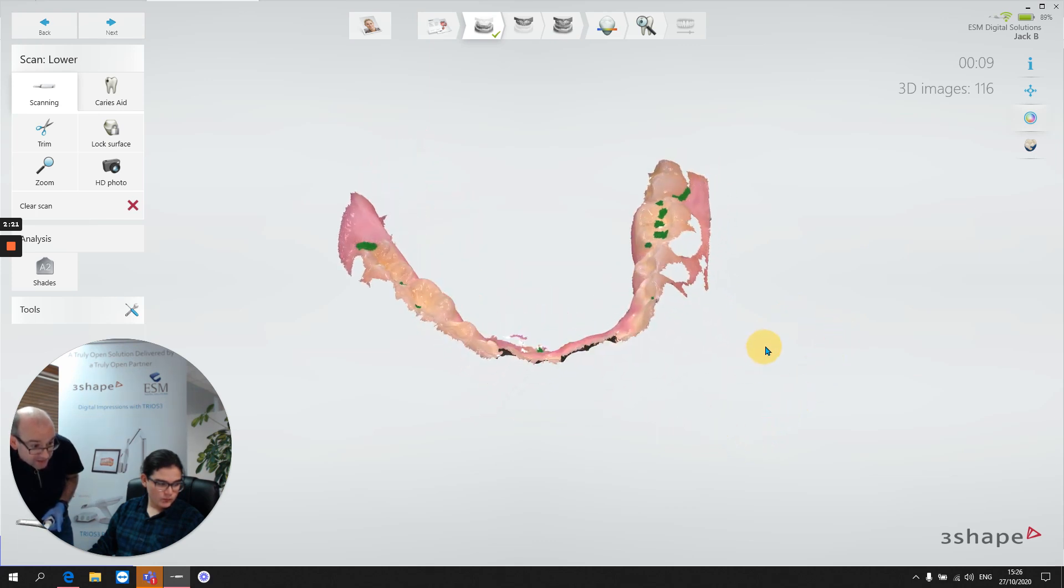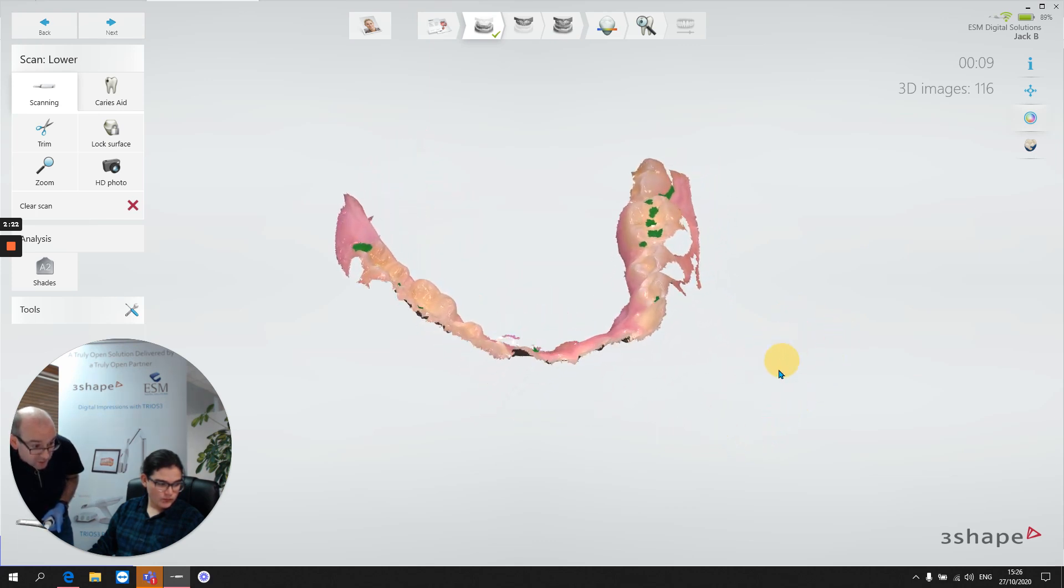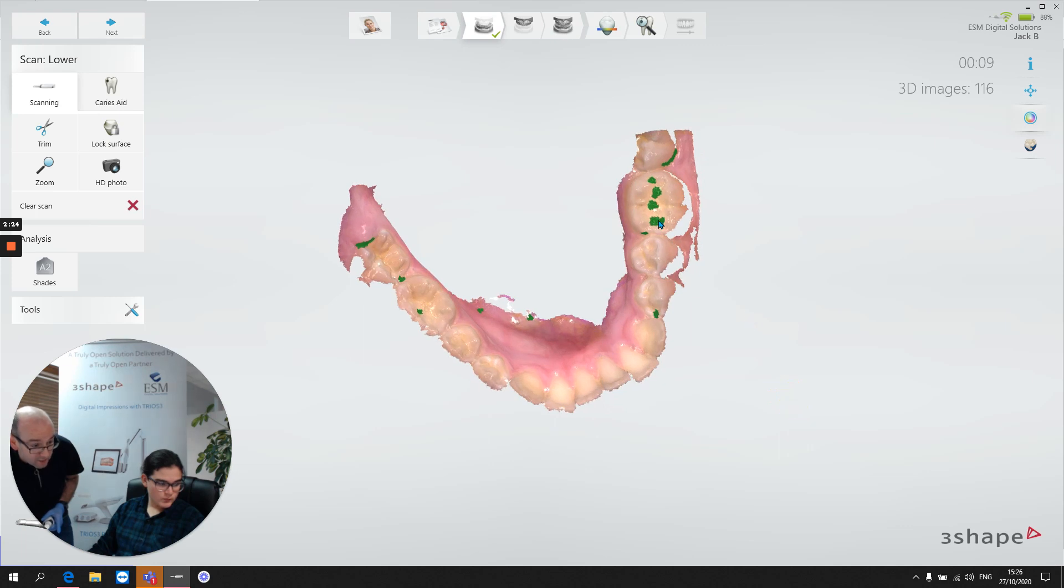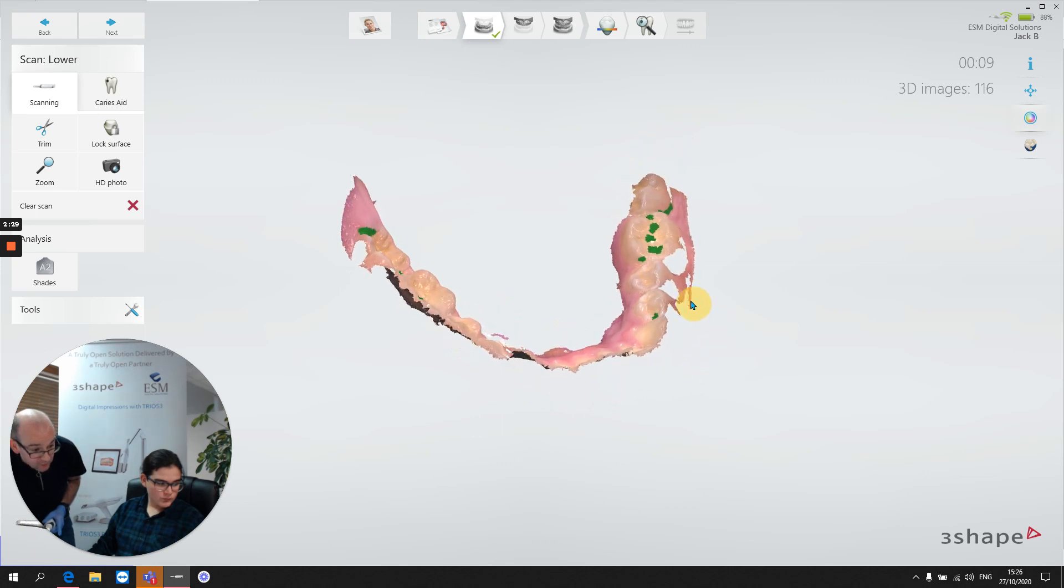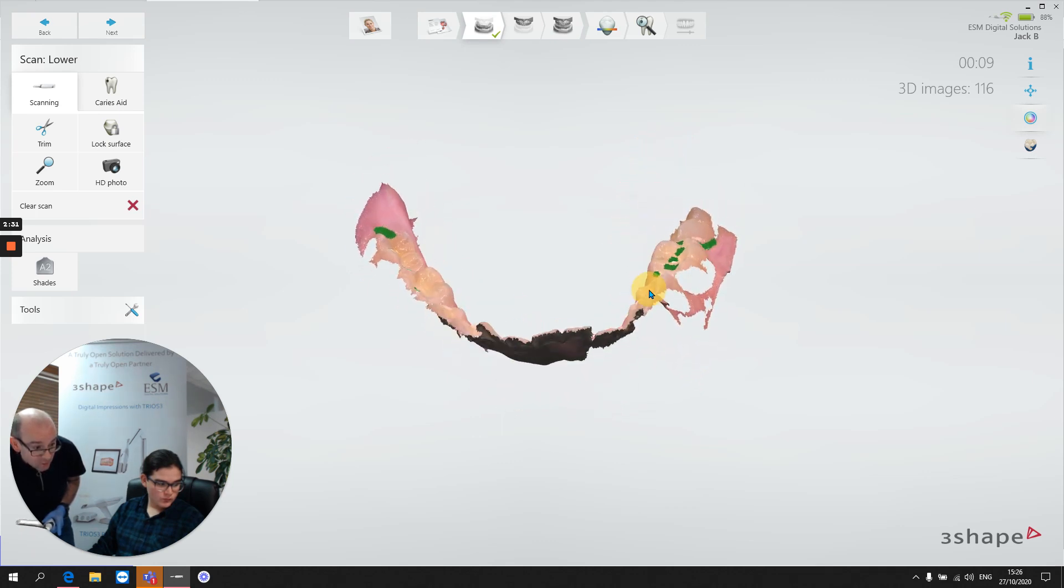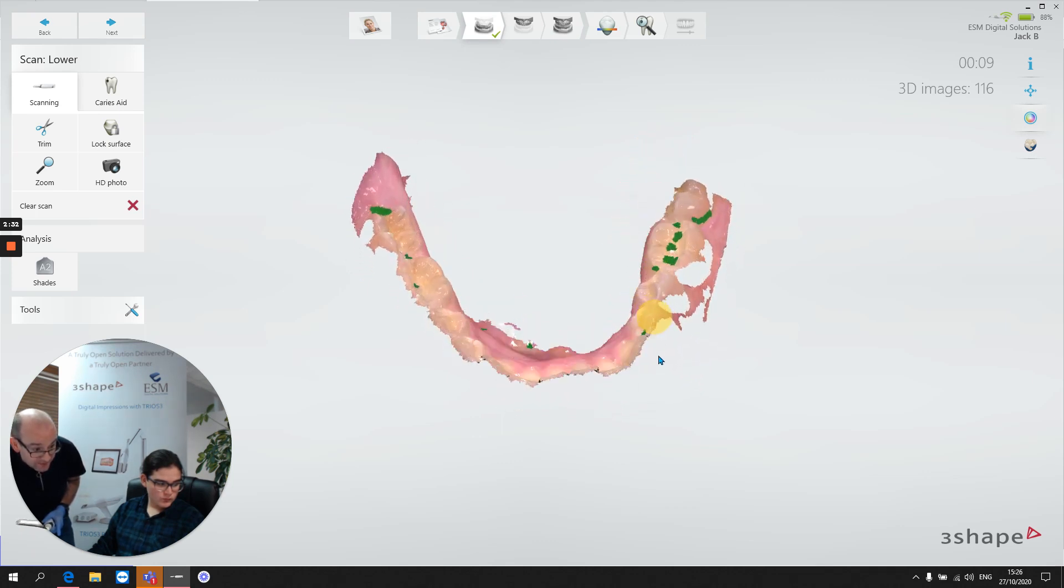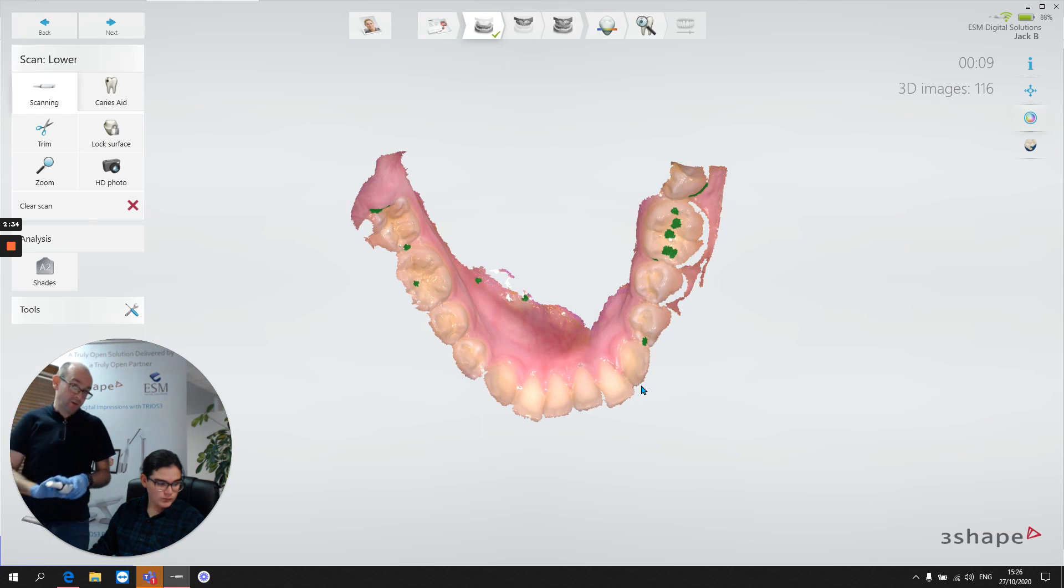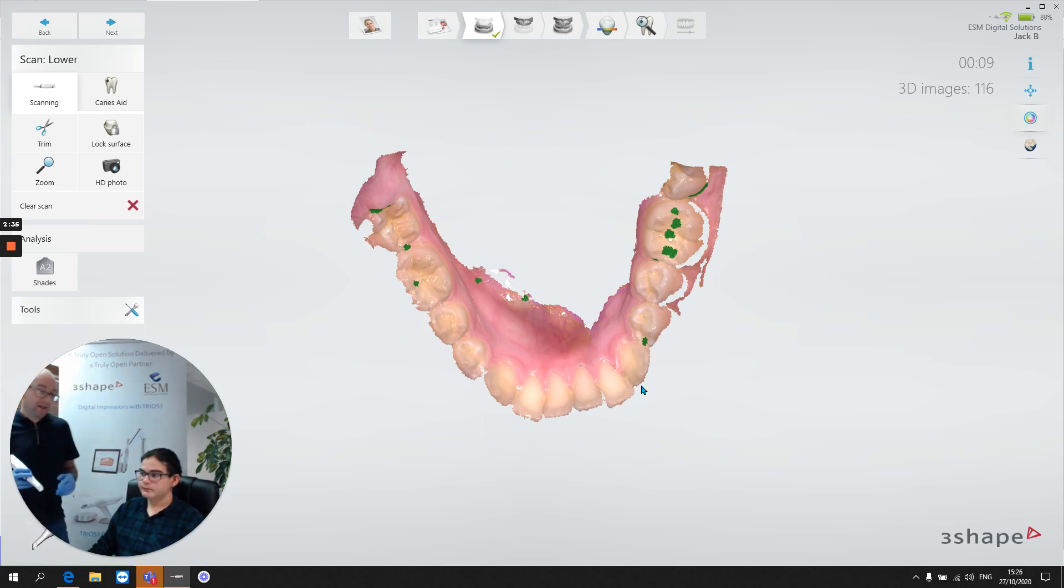So the result of that is that we're going to end up with, number one, we're not sure how accurate and how reliable that interarch width is, and number two, when we come to doing the buccal scan, there's a risk that it may not stitch properly. So I'm going to try and simulate that now.